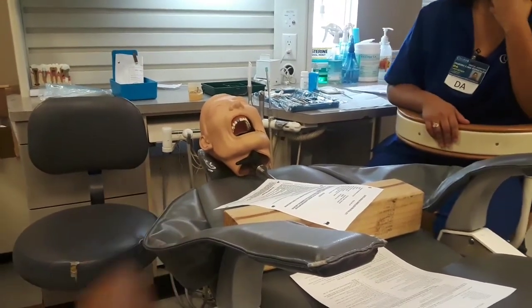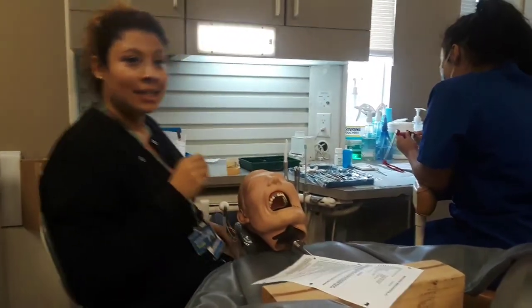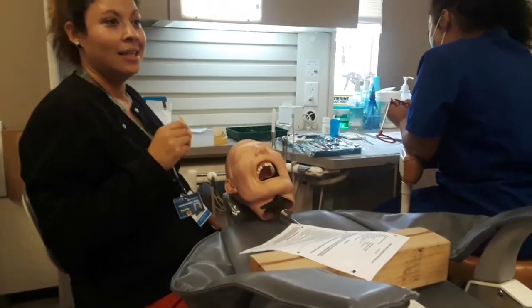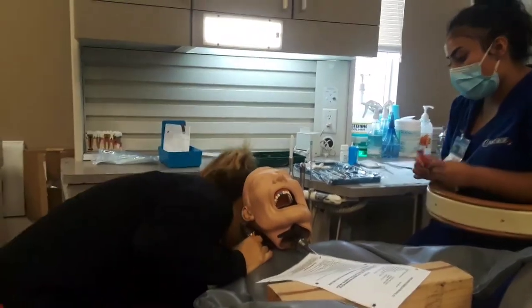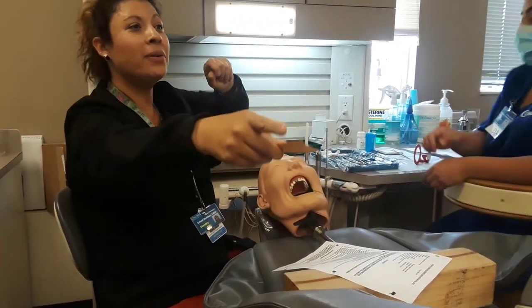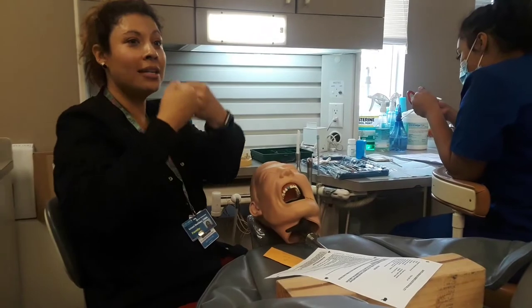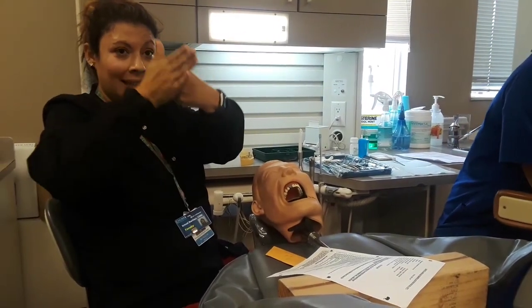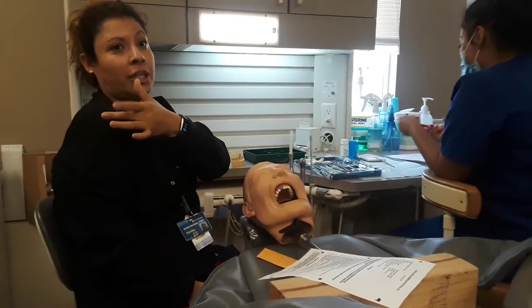I'm getting a bite wing because — see if you guys remember — what is a bite wing? What does a bite wing diagnose? The bite? No. What does a PA diagnose? Periapical lesions. A bite wing diagnoses interproximal. So in order for us to see the interproximal — remember we cut that mesial and distal off two millimeters — we got the margin to look at. We need a bite wing to view that margin because it's interproximal.